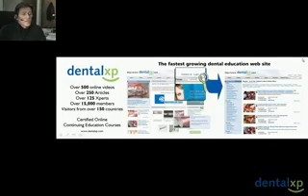There are many systems today that offer pre-contoured or aesthetic abutments, and we prefer to minimize the amount of preparation that's needed. If preparation is needed, we prefer to do what we do in the lab, where we do a reduction coping. The lab tells us how much needs to be reduced, and we place the coping over the abutment and then prepare it out of the mouth on a model before we insert it.